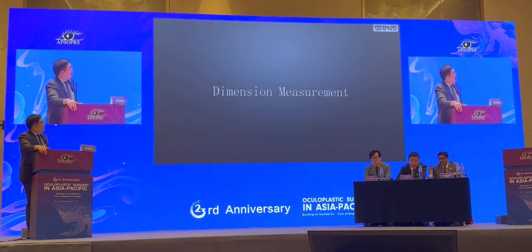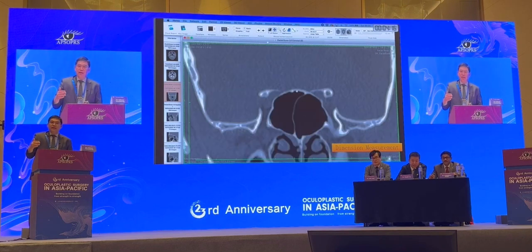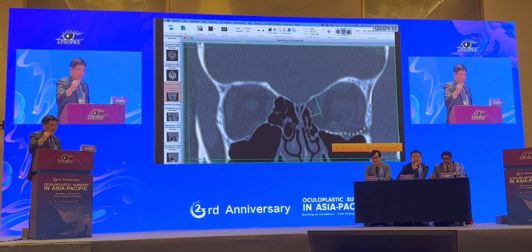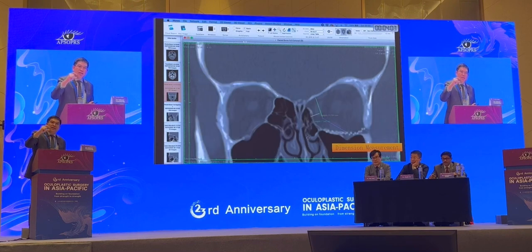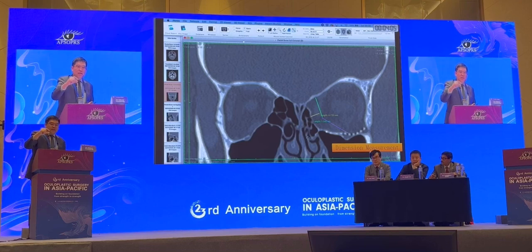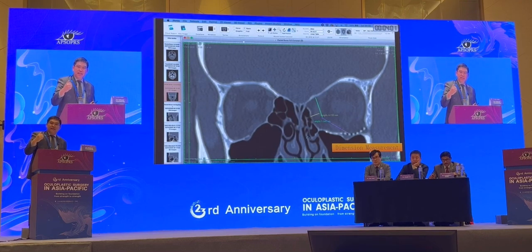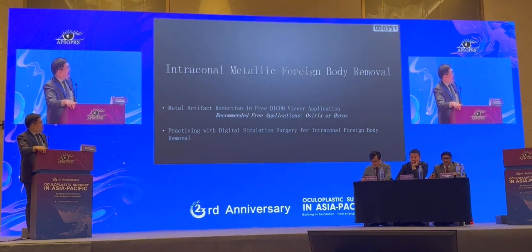And it's very good for the presentation also. For the dimension measurement, one of the modes used for measuring, you can measure how many millimeters of the broken bone has dropped, and you can bend the implant before the surgery. In the old days we just went in and cut, put in, put out, put in, put out. But nowadays we do more customized, more patient-specific implants.